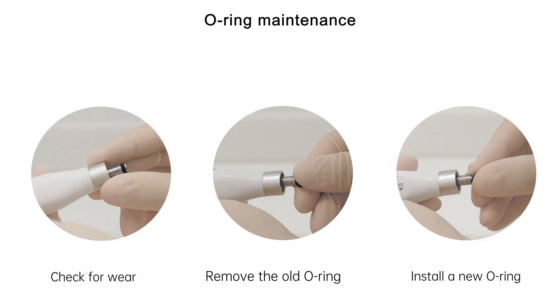O-ring maintenance. Check for wear. Remove the old o-ring. Install a new o-ring.